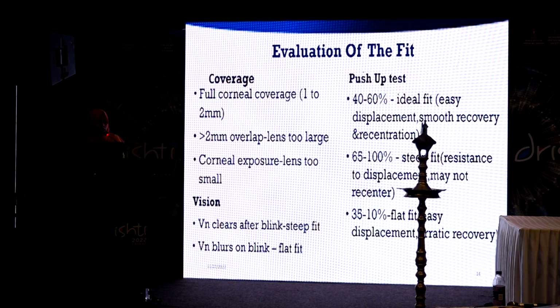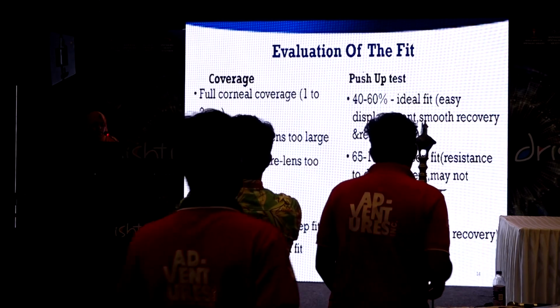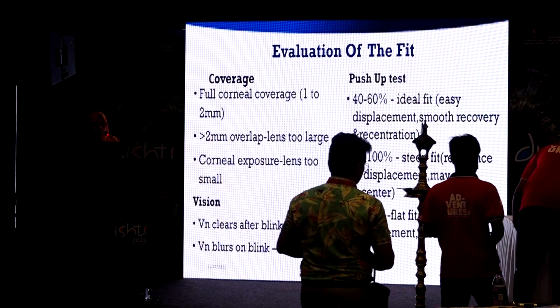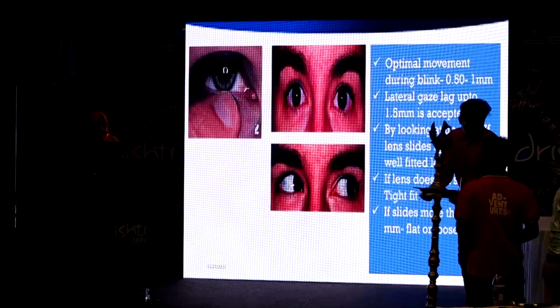And we have to check for the vision. Vision clears after blink, it is a steep fit. Vision blurs on blink, it is a flat fit. And also the push-up test, you have to check: ideal fit will be 40 to 60%. So there will be an easy displacement, smooth recovery and recentration. And if it is 65 to 100%, it will be a steep fit. And if it is 35 to 10%, it is a flat fit.